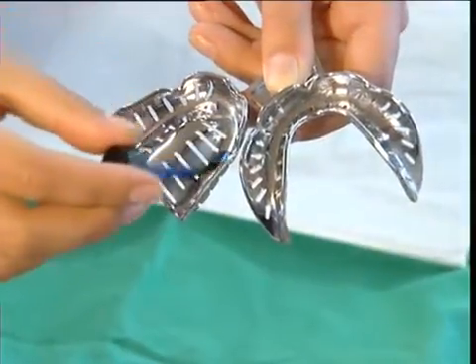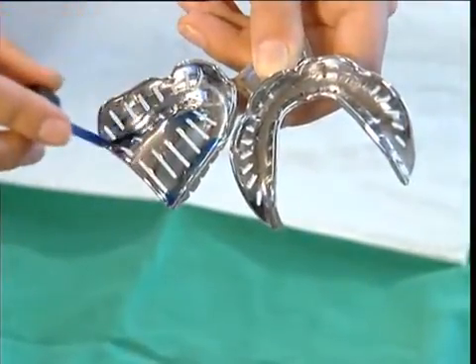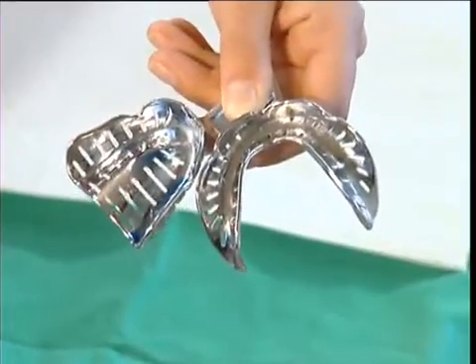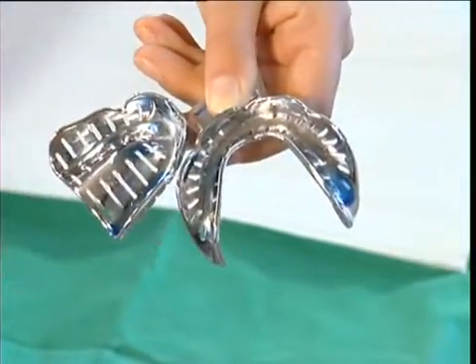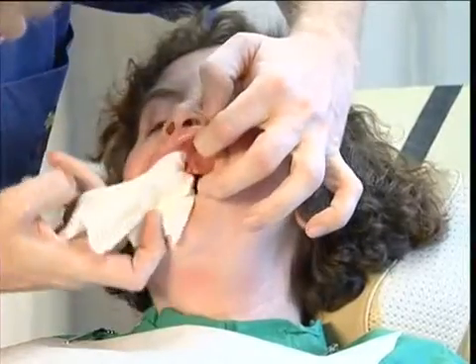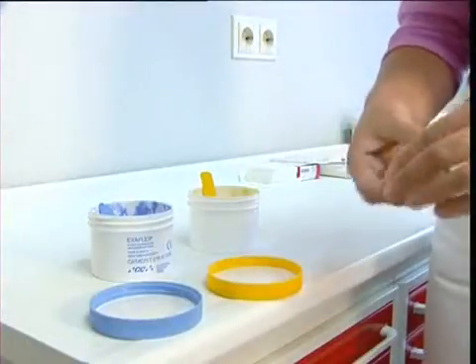In this case, the anatomical impressions are to be taken in Schreinermacher's perforated metal impression trays, which are pre-formed to fit the anatomy of an edentulous jaw. Both trays are coated with silicone adhesive to ensure that once the silicone is set and the trays are removed from the mouth, the silicone cannot detach from the tray. The jaws are cleaned with gauze and kept dry, while the assistant prepares more blocks to act as stops for the final impression.